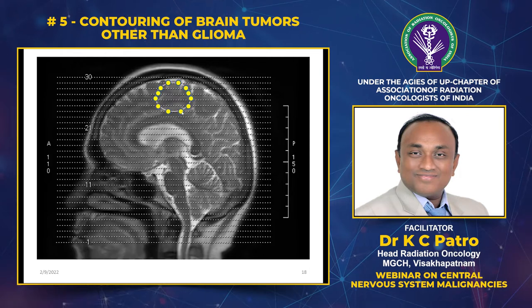This is your tumor. After fixing this point, suppose you had a glioblastoma or high grade tumor, you give a 2 cm margin around this and then you open the field like this, either a rectangular field or a square field according to your choice. So this is the basic reconstruction of the tumor on the topogram. And if you want, you can take a check X-ray after that. So these are the two things you need for this tumor reconstruction: the topo as well as the scale.